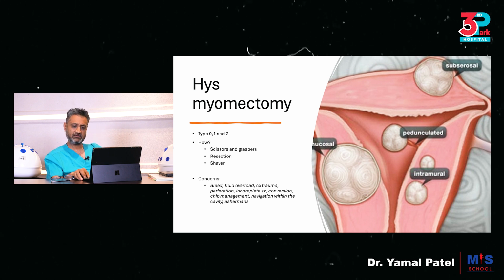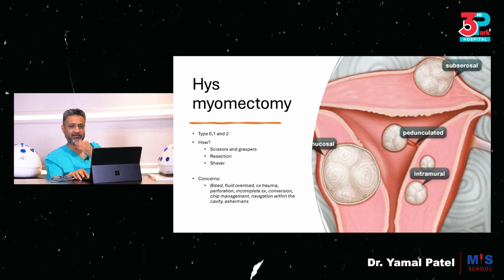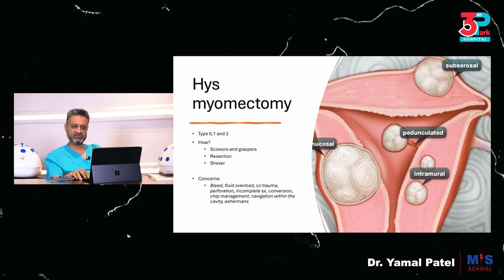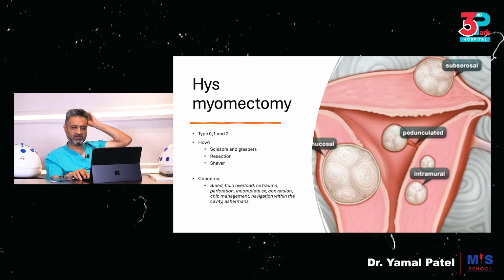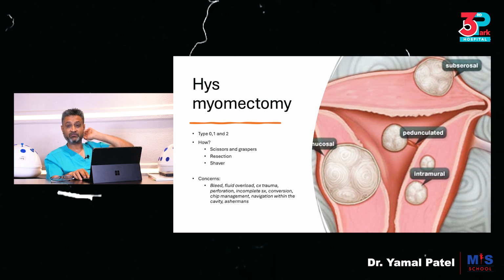Incomplete surgery, conversion to an open or a laparoscopic is likely. Chip management, when you're doing resection, those small chips that you're removing, managing them correctly to make sure that they don't collect in there and disrupt the view is important. Navigation within this cavity is a challenge, and leading to Asherman's after could be a challenge. So these are challenges or concerns with hysteroscopic myomectomy.